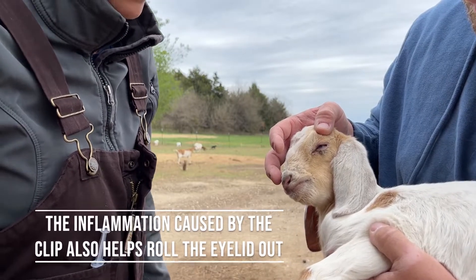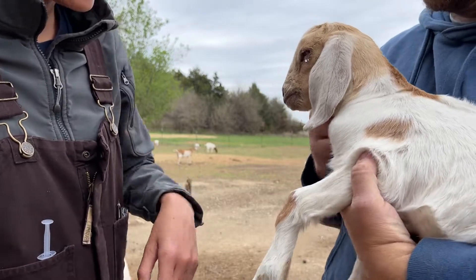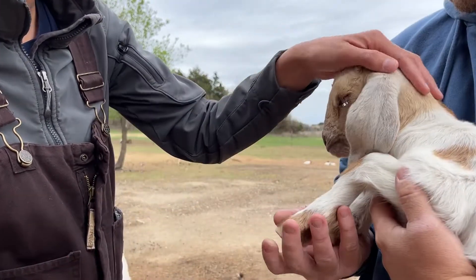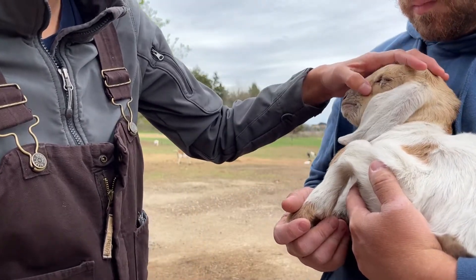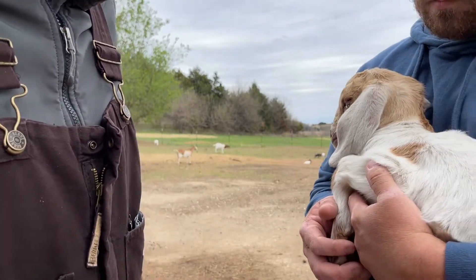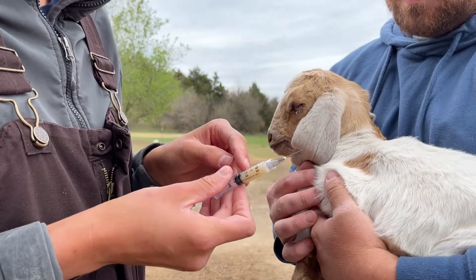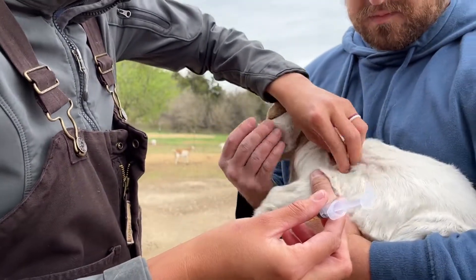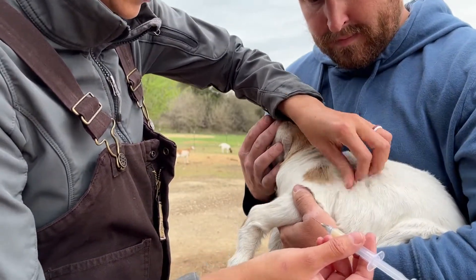We're also going to put a little terramycin ointment on there, and we're going to go ahead and give her her CDT vaccine to vaccinate her for tetanus, since we just created a wound where the wound clip went. We're going to do a sub-Q injection — this is two cc's using a 22 gauge, three-quarter inch needle. I'm going to do this sub-Q, feeling over the ribs.